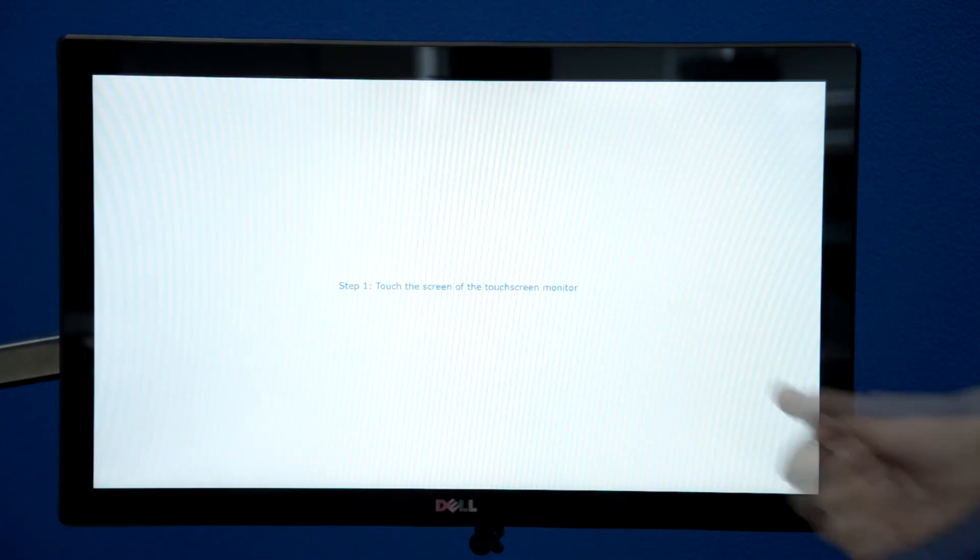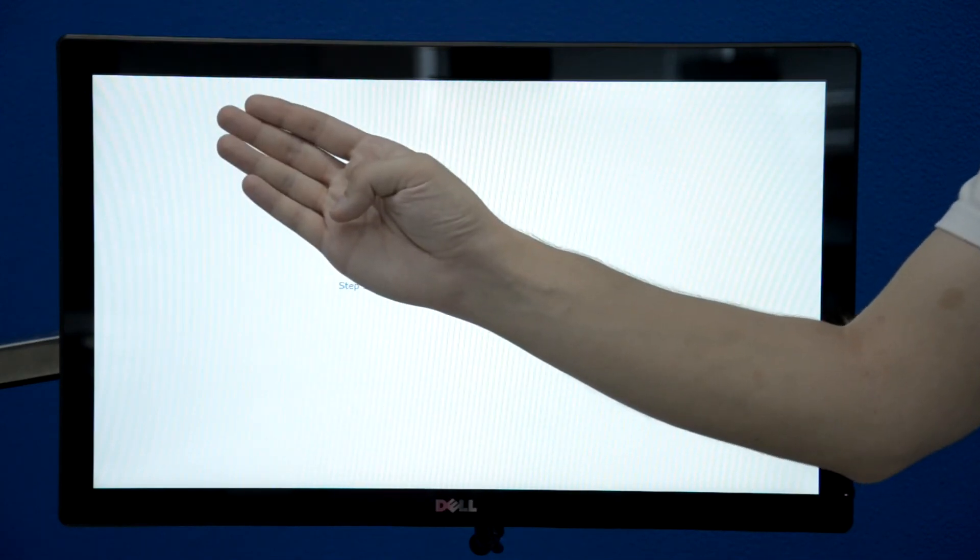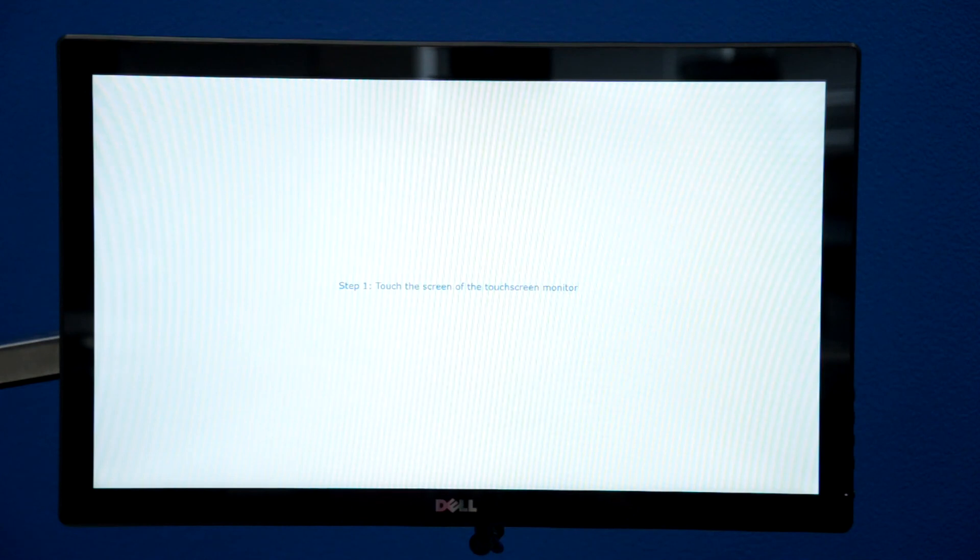For example, the touch screen is number one and the upper monitor is number two. After an update they can be mixed up.